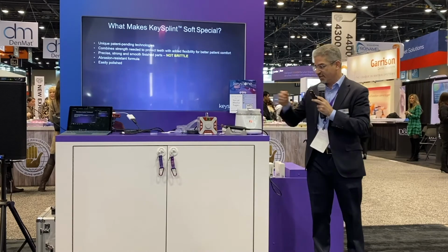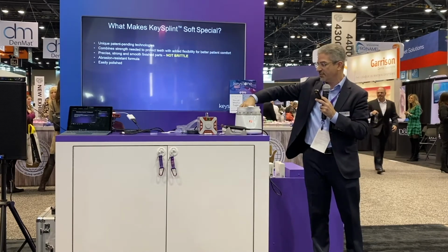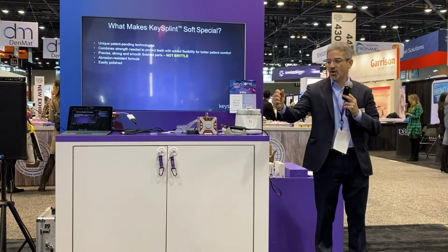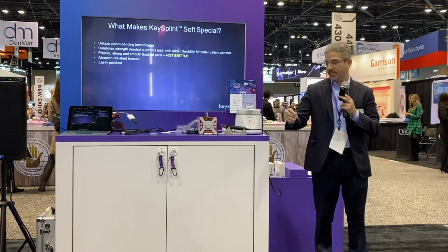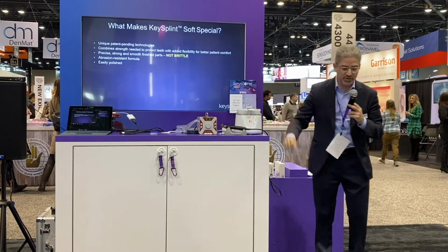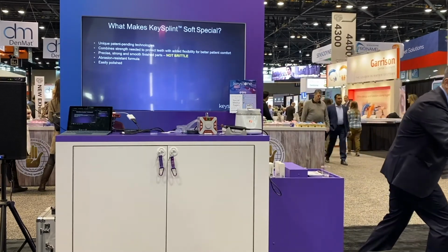I'll give you guys a chance to see what it feels like, touch and feel it at body temperature. Here's 37C. You can see it softens and becomes much more pliable. I'd be happy to pass a couple around if you guys want to try them at body temperature. Sorry for how wet they are. Thank you, Sasha.